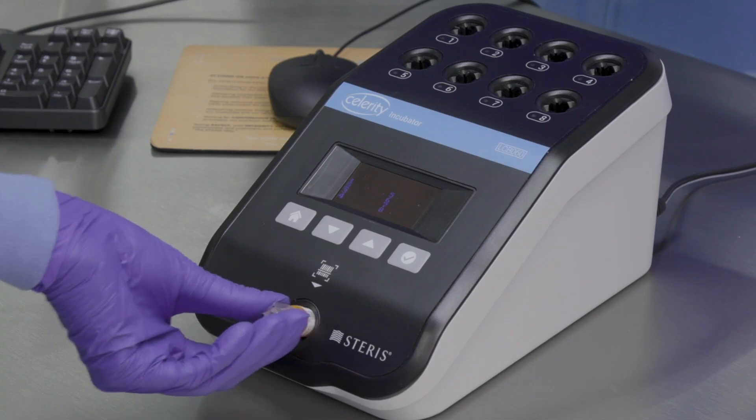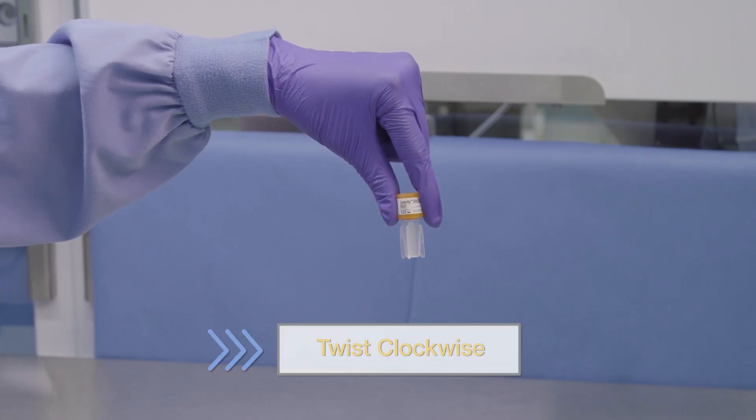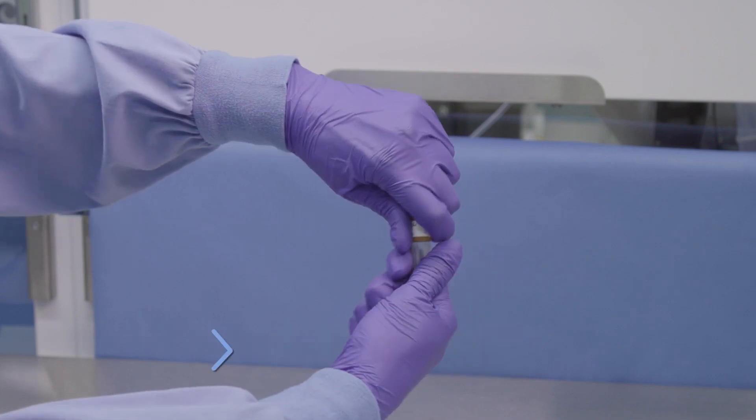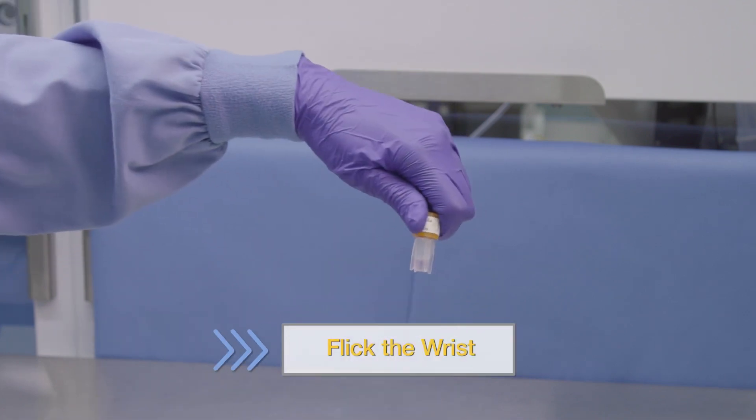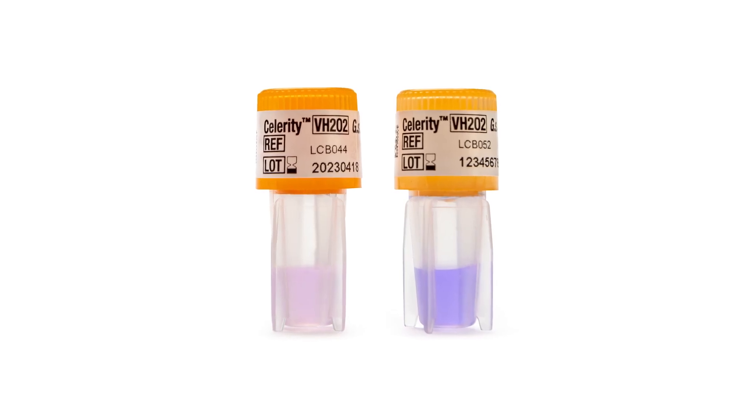Scan the BI using the barcode scanner on the incubator. Then activate the BI by twisting the cap clockwise until resistance is felt. Transfer the media from the cap to the vial by holding the BI firmly by its cap and flicking the wrist once. The media will be pink or purple.